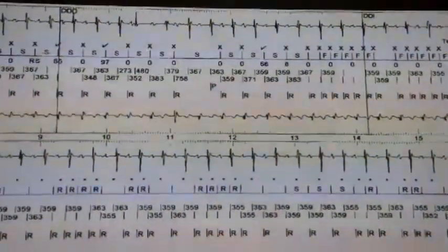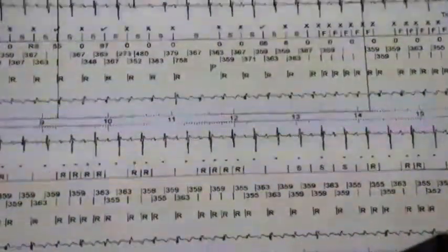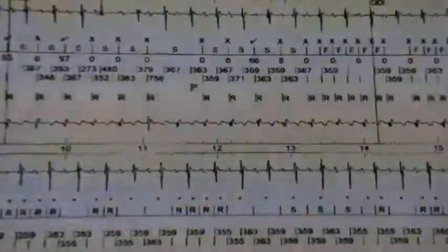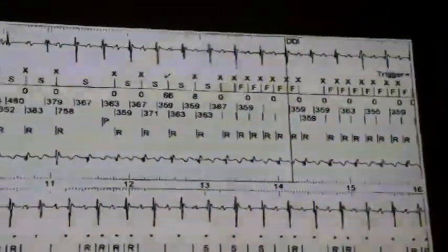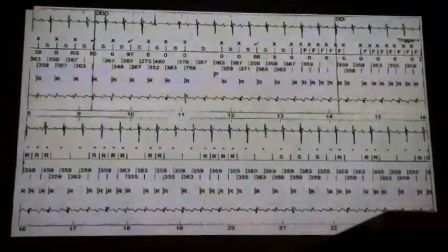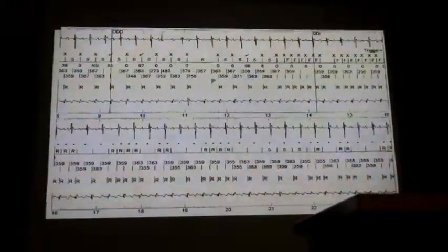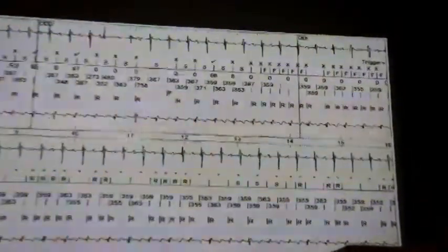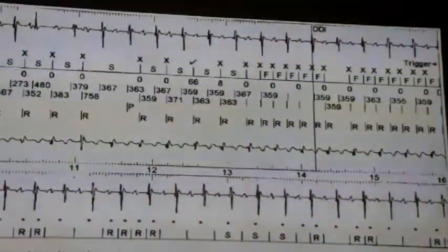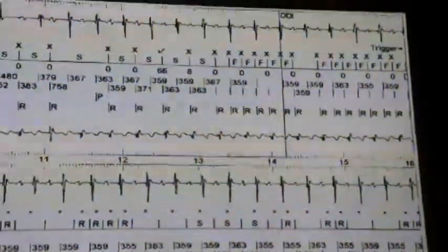This is saying that this RR interval is in the sinus zone, which is any zone lower than the VT zone or the VF zone. Fib is in the fibrillation zone, and blank means there's a mismatch between the actual interval and the average interval. It's one of the binning rules on an Abbott device. If you go into the cardio cases, it'll explain that algorithm in detail. It is sensing in here, it's just not classified that RR interval. The template is right or wrong: X is a non-match, 0 is the score.